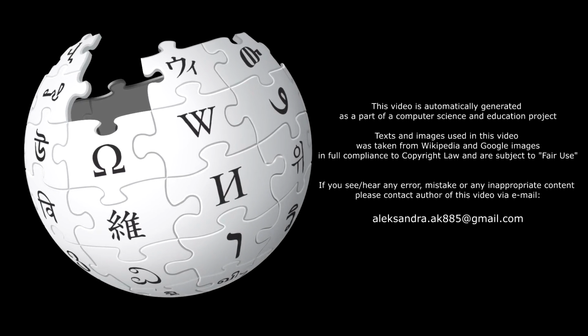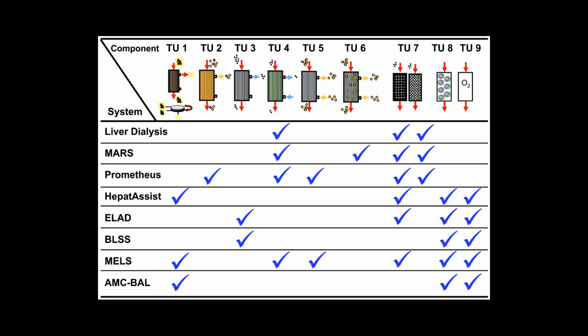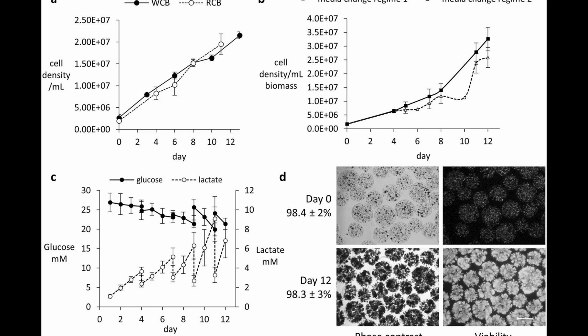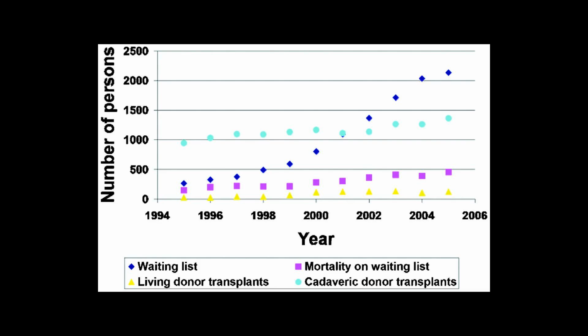A bioartificial liver device, BAL, is an artificial extracorporeal supportive device for an individual who is suffering from acute liver failure. History. Early history. The first bioartificial liver device was developed by Dr. Kenneth Matsumura and was named an Invention of the Year by Time magazine in 2001.